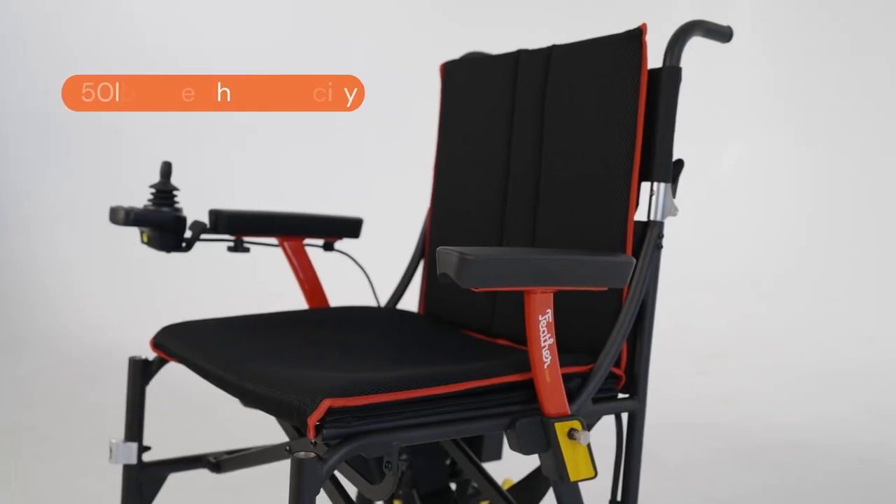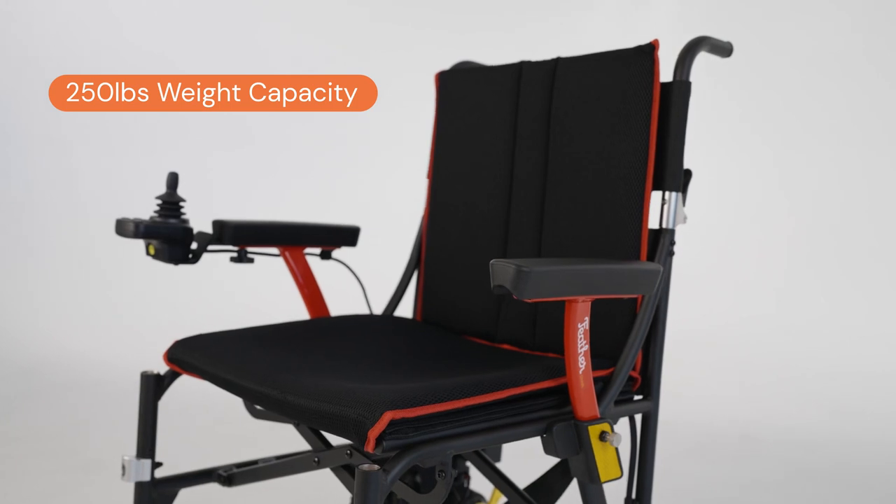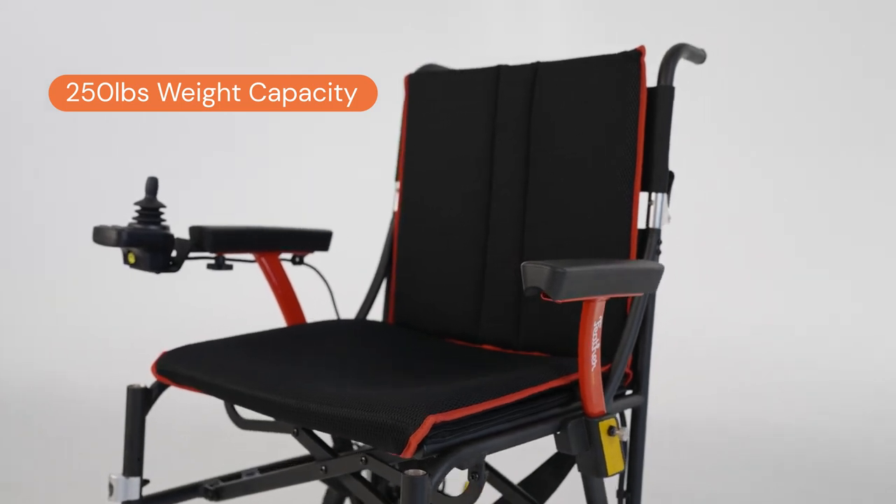It has a 250-pound weight capacity, so anybody under 250 pounds will love this chair and fit and sit comfortably in it.